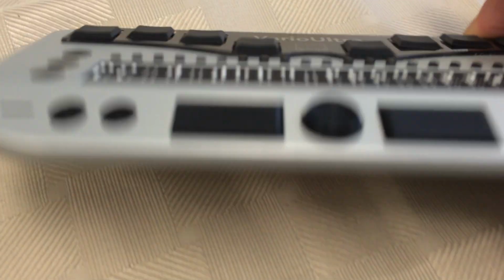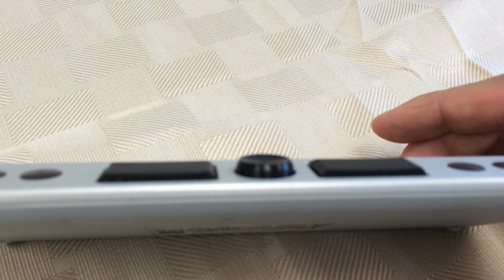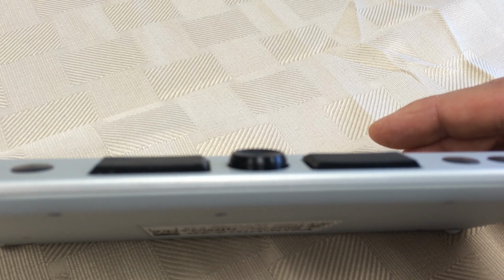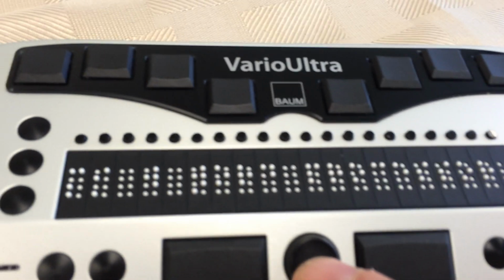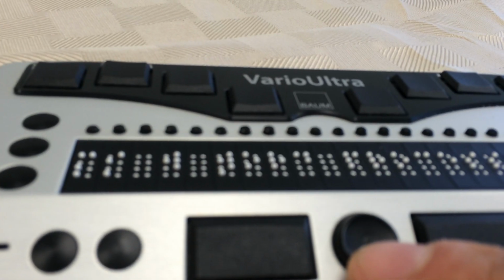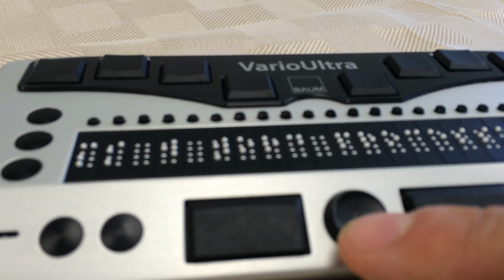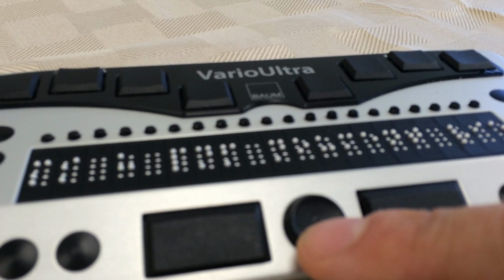And then in the middle, and again, I'm going to put this device at a slight angle so those people who are sighted following along here, you can see that there is a circular button in the middle of the 2 space bars. This is the Navi stick. And what I can do is, as I press on in this case, the bottom part of that circle, the Braille display is changing. So I'm actually going through the menu items.